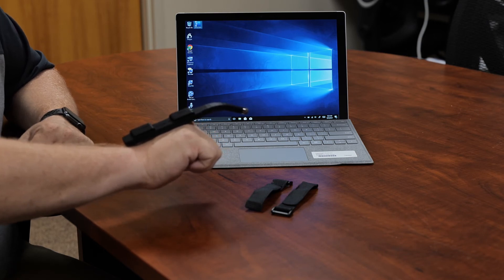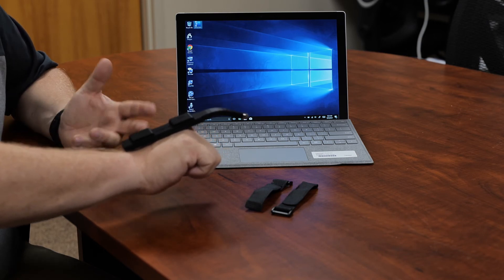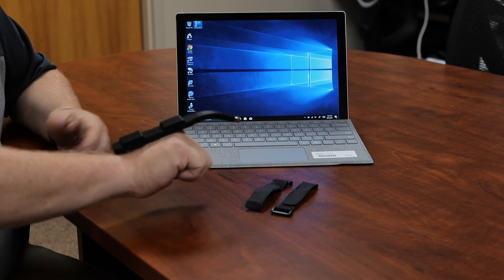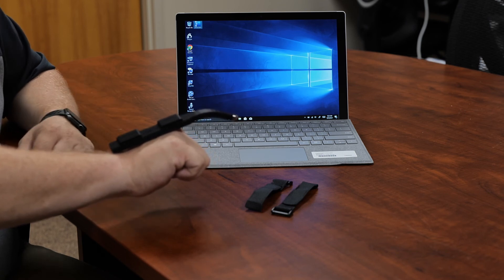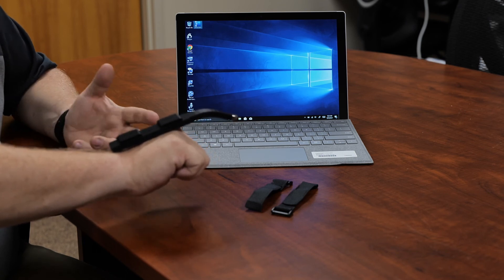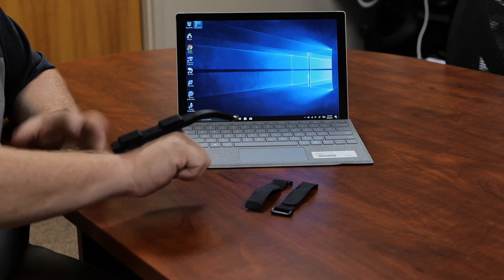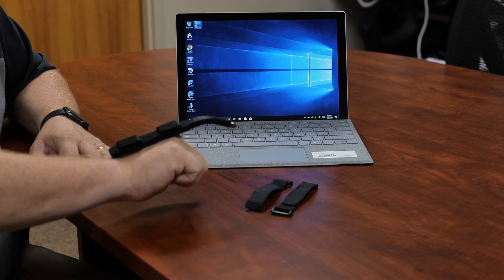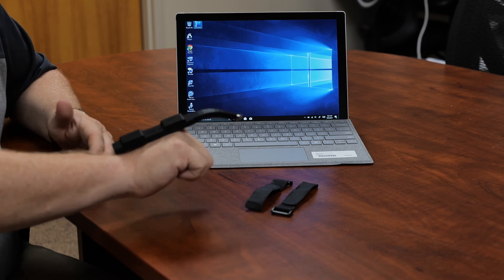And so just a real simple way, again, if folks have difficulty using a touch screen, for them to be able to use a device like this to be able to give them greater access.